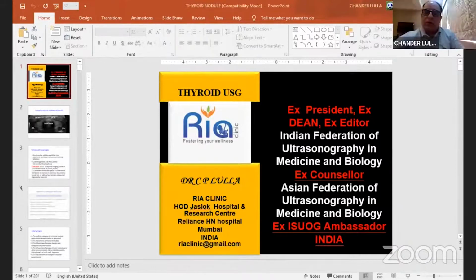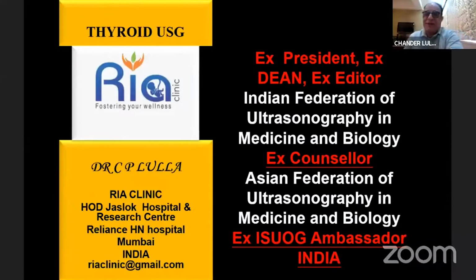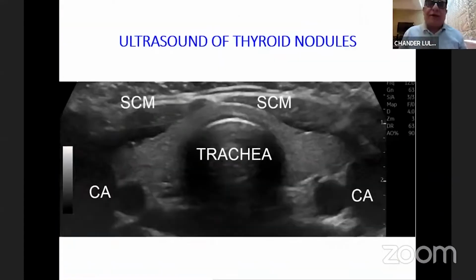So I've been practicing actually for 30 years, not 37 years, but that's okay. As we begin with the ultrasound of thyroid nodules, we must remember that ultrasound has been a foremost imaging modality for the neck, as has been highlighted by Dr. Rakesh and other speakers before me.